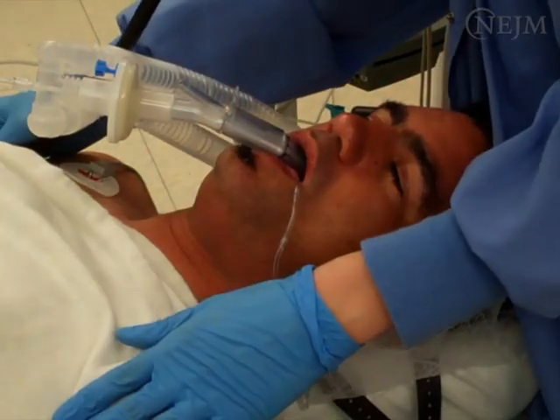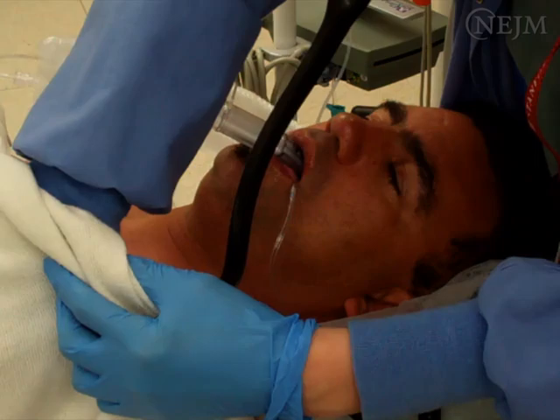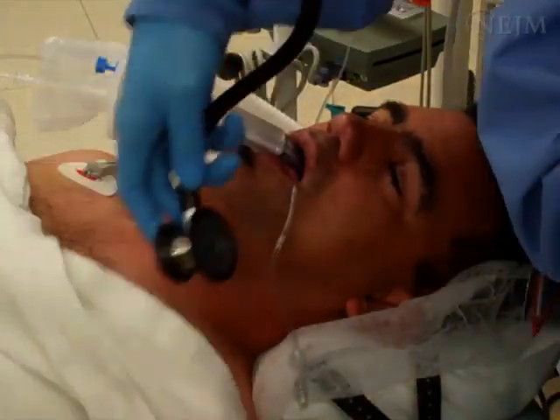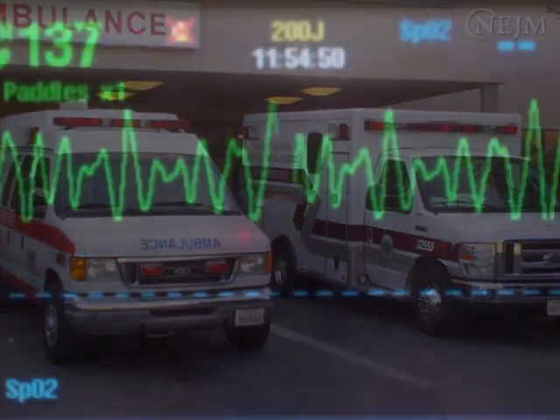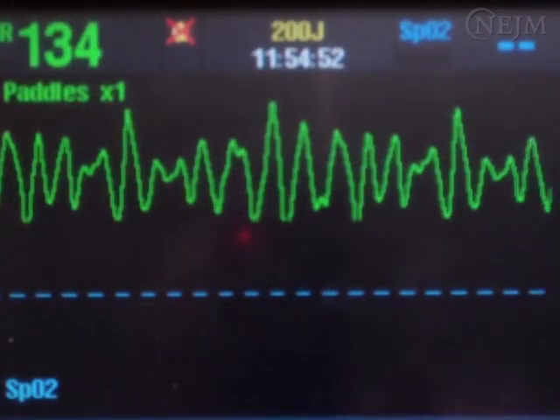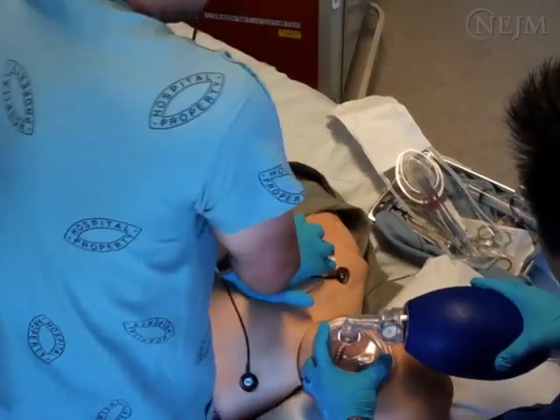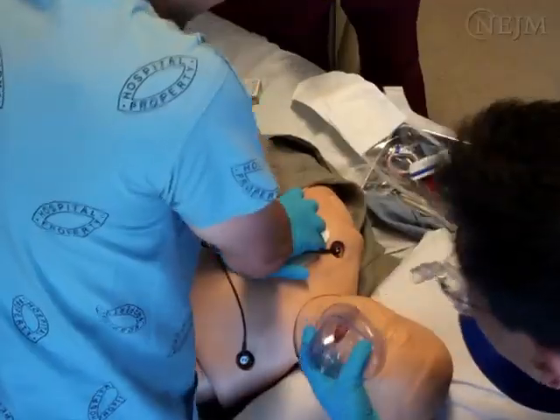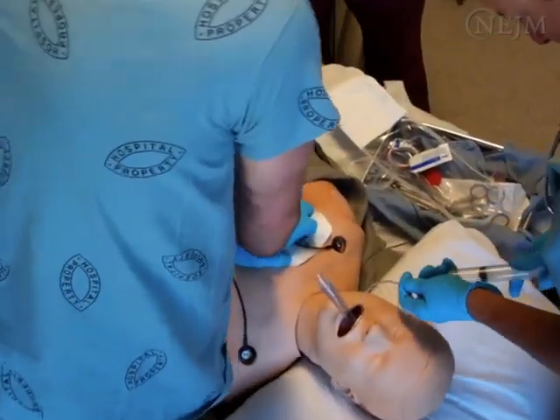The laryngeal mask airway is a device used routinely by anesthesiologists for surgical operations. Its use should also be strongly considered for ventilation in pre-hospital and in-hospital cardiac arrests. Both the American Heart Association and the European Resuscitation Council consider the laryngeal mask airway an acceptable device for use by non-experts in tracheal intubation when performing emergency airway management.